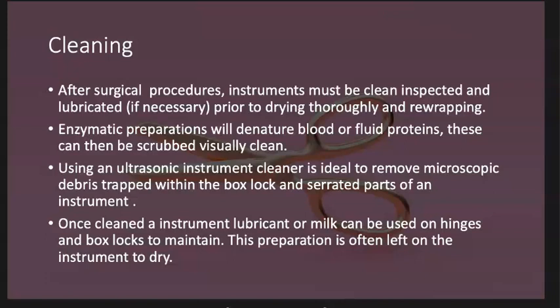Most instrument lubricants come in a spray bottle, so application is rather easy. Instrument milks come in a concentrated formula, and a dilution factor is often used. The instruments are placed in a basket and then into the surgery milk so they can soak. After the soaking period, they can come out of the instrument milk and be left out to dry prior to an inspection before re-autoclaving or sterilizing.